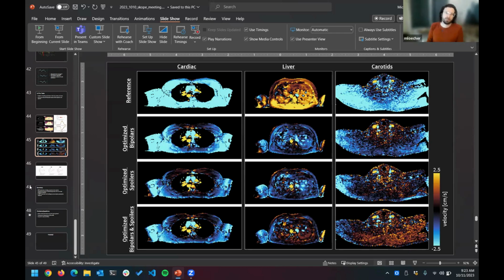Yeah. And so this could be helping with that, especially if we start adding the higher order terms. Yes, I mean these higher order terms are causing other errors besides just background velocity too, maybe is what you're getting at. And actually, one of the reasons we started this project was because we had some 3D cones flow experiments where we thought not just background velocity, but actually trajectory errors and things were happening during the readout because of the bipolar gradients. This might help with.